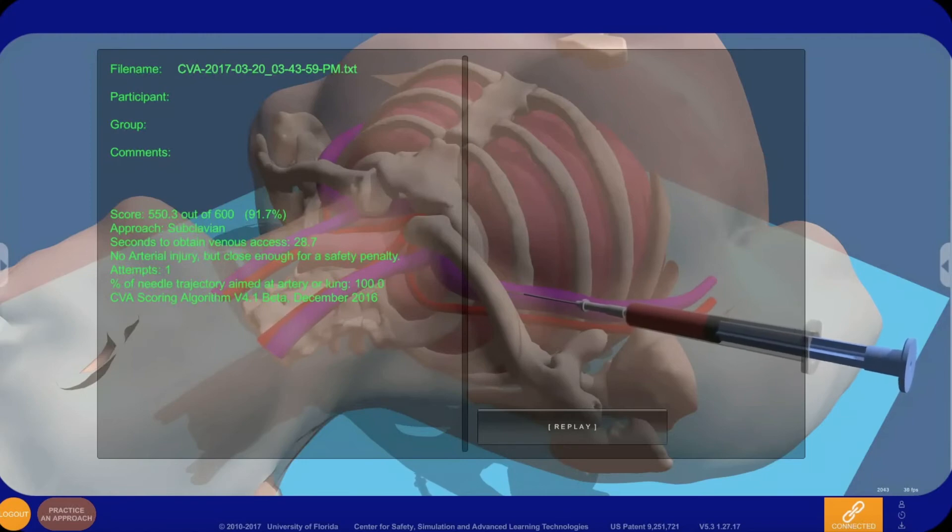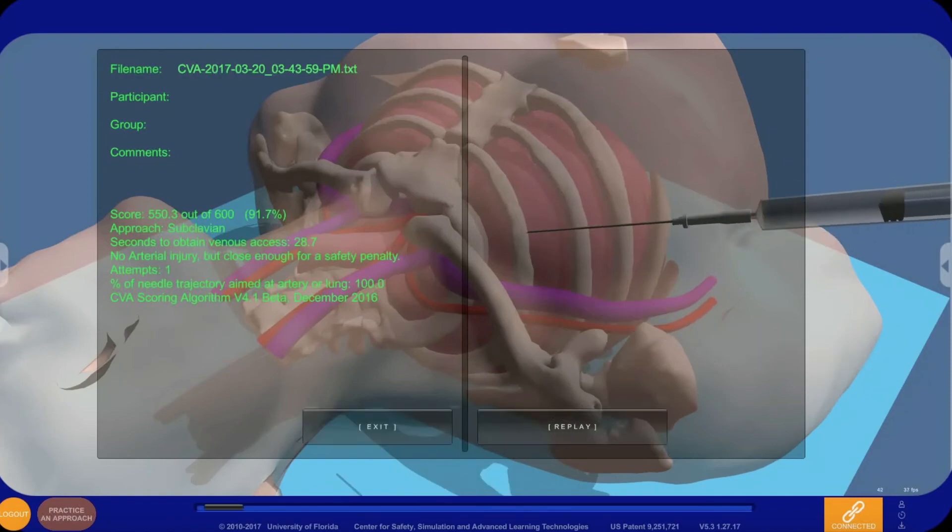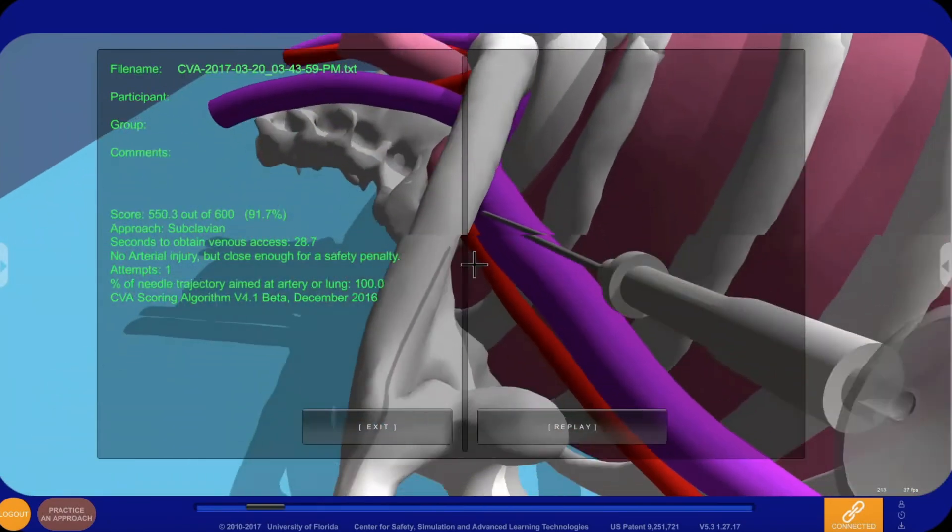Scores are based on time, anatomical structures punctured, ultrasound technique, and proximity to no-go areas.